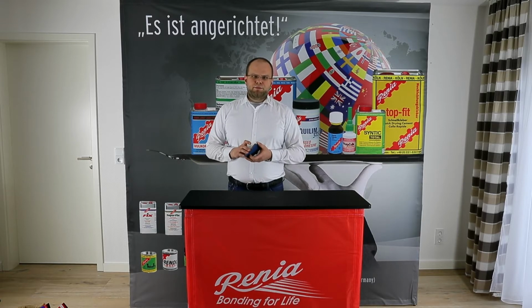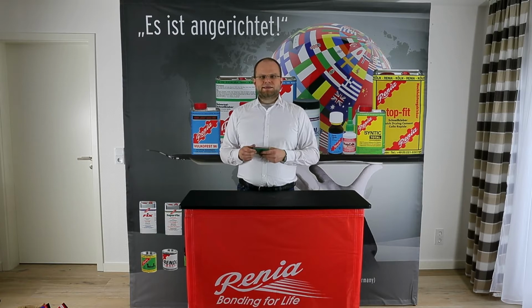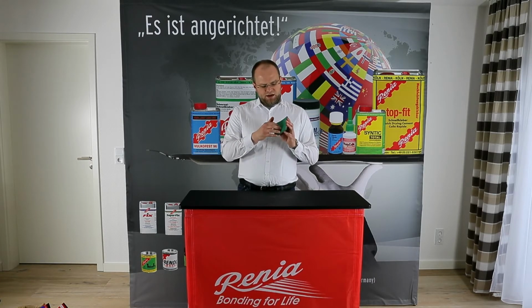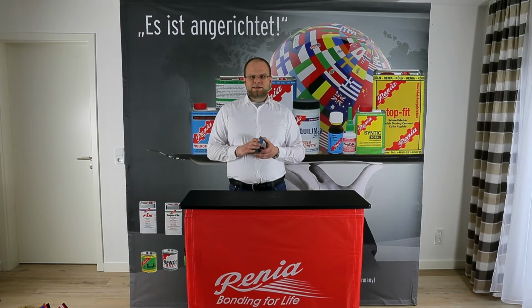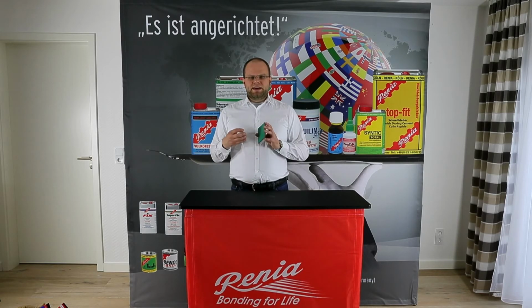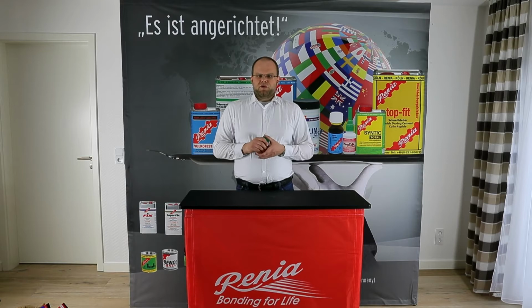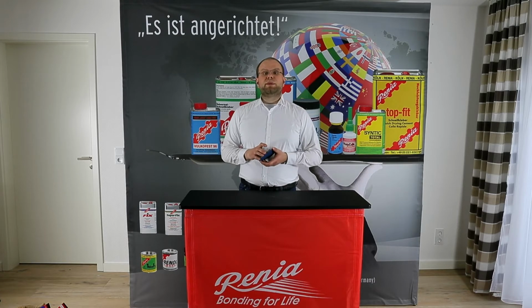The first one is be wary of potential contamination with separating or mold release agents. Polyurethane expands into a mold or onto something, and in order to get it out of that mold, very often mold release is used, which can then still be on the surface unless it is cleaned off. If it remains on the surface, or if anything else, like oil on a blade used for splitting, gets onto either side of this material, it's often sold rolled up. So, of course, what is on one side will transfer to the other, and you might get separator mold release in the most unexpected places.